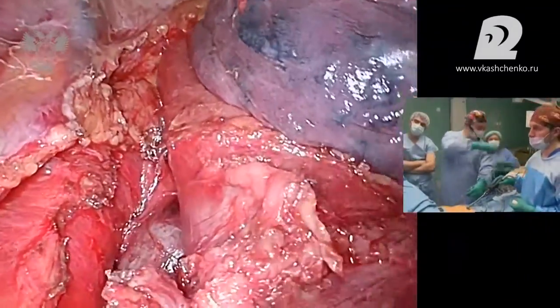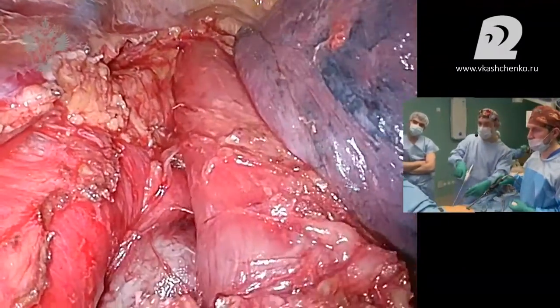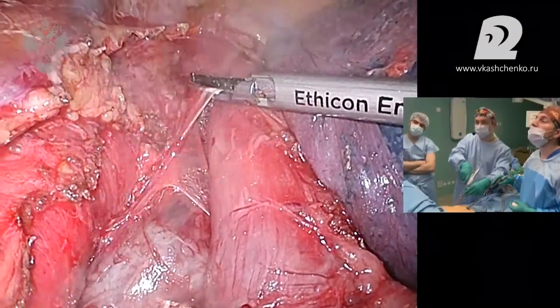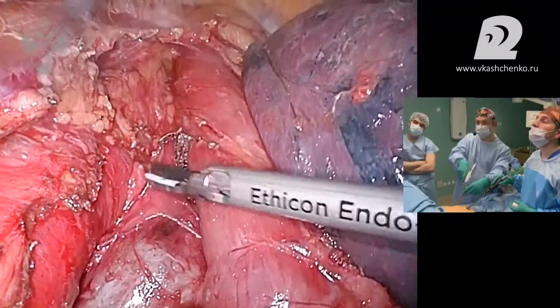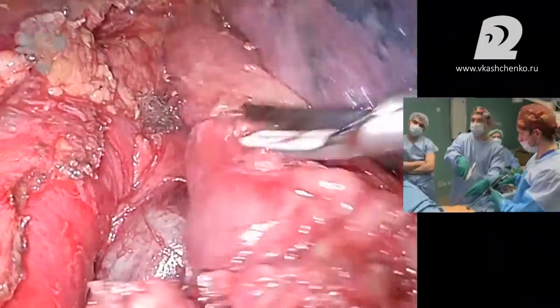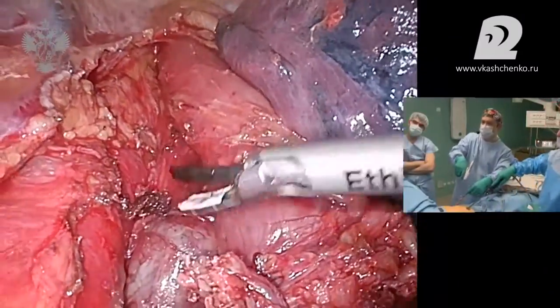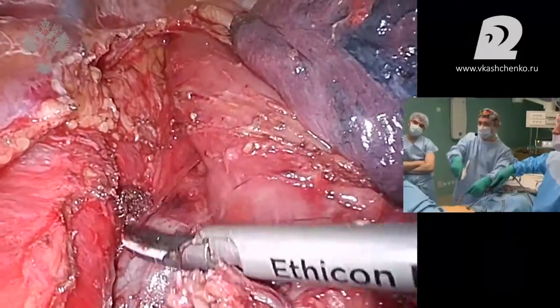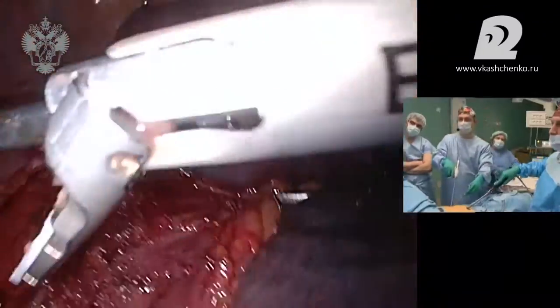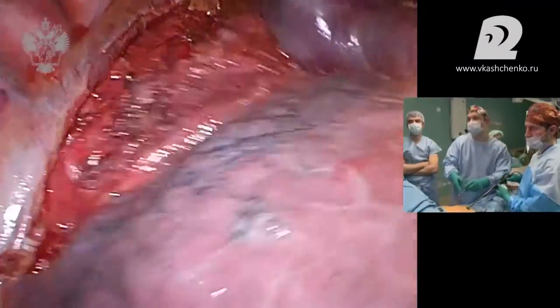Огонь. Я пищу этот самый гармоник, давай. Сергеевна, она хочет меня поздравить, но нет необходимости, не сейчас. Ну, ребят, в принципе, тут все в порядке, назад. Покажи мне, где уровень азигос, Женя. Обрезанный азигос, это как раз он и есть, да?